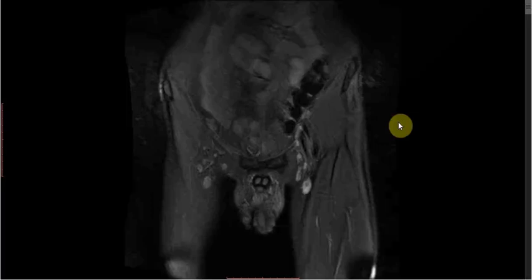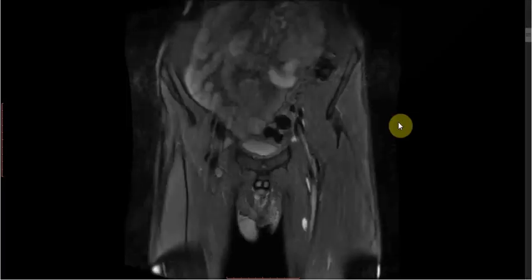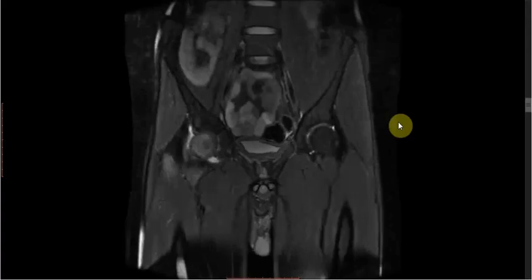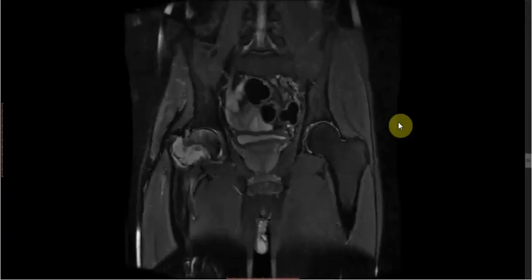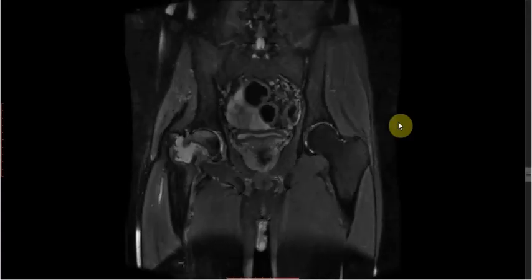This is the case of a 23-year-old male patient who presented with sudden onset of pain in the right hip joint after a trivial fall. This is the coronal T2-weighted sequence.